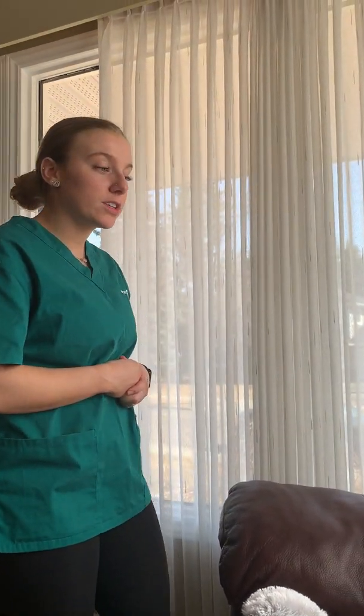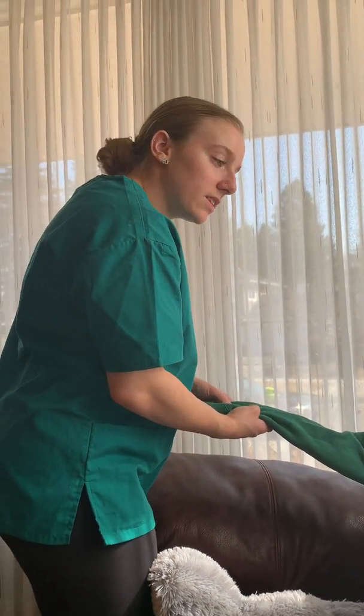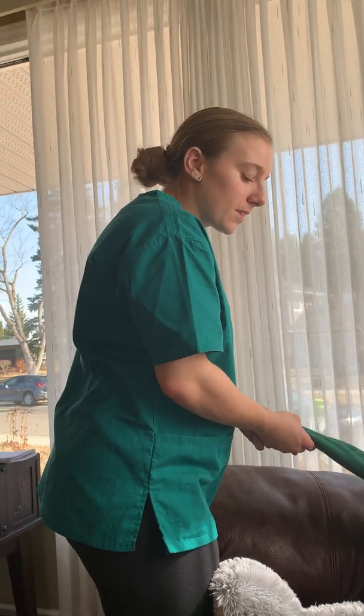I will introduce myself. Hello, my name is Kaylee and I will be your nurse today. I will then check 2 identifications on the patient. So can I get your first and last name, Roger Stevenson, and your date of birth? Then as well, I will ask them 3 questions for LOC. So do you know where you are?